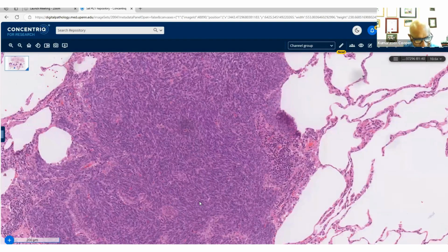That's exactly the reason why I always ask for a differential diagnosis, because when I put this slide on, I never even thought of an intimal sarcoma, but it's great because then we can talk about it a little. Intimal sarcomas typically occur in the pulmonary artery. Sometimes they grow so extensively you cannot even be certain that they're arising from the pulmonary artery. They involve the aorta, they can even involve the pericardium. But generally, the surgeons would tell you that the pulmonary artery or vein is involved as well.